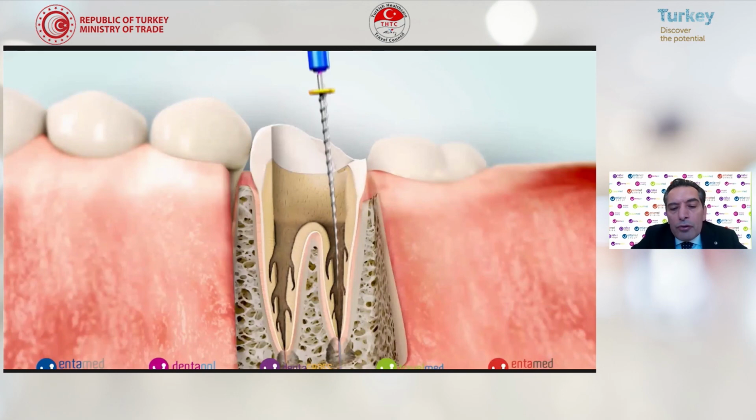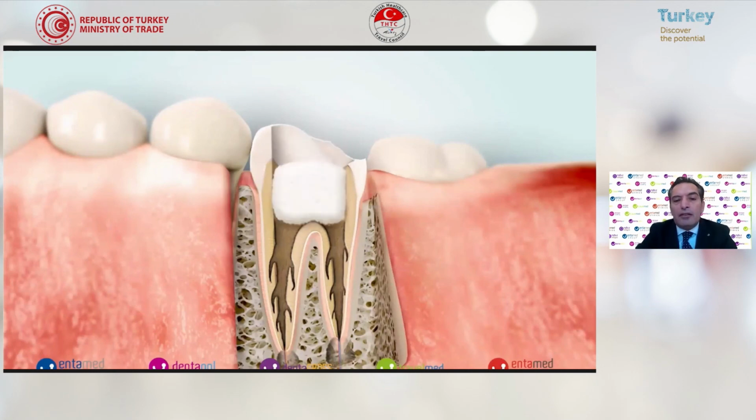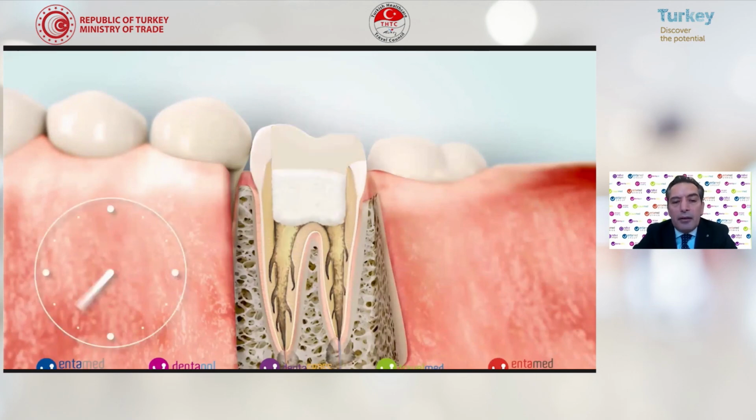Because these teeth have lesions. You see in the apex of the teeth, these are big, big lesions. So we have to make several cleanings in such teeth. Then place again the temporary filling, and wait for a while again. You see the healing in the roots.